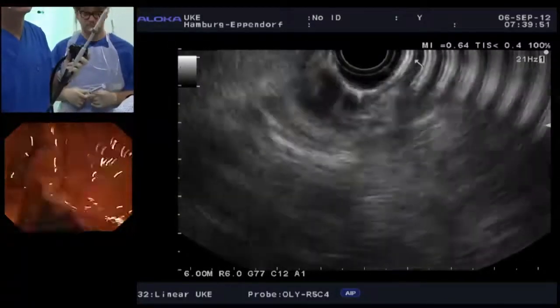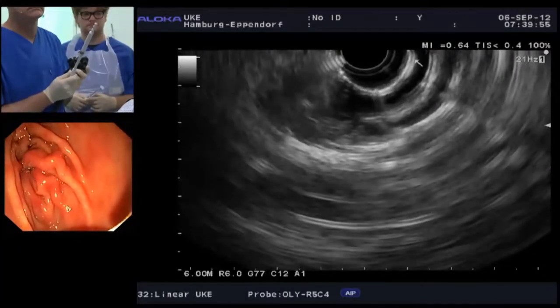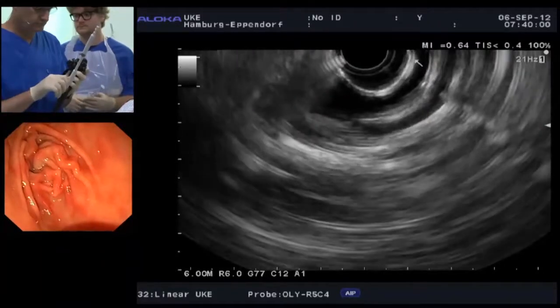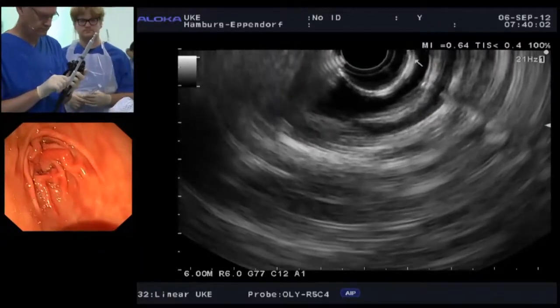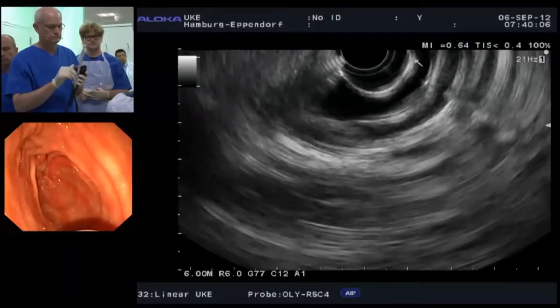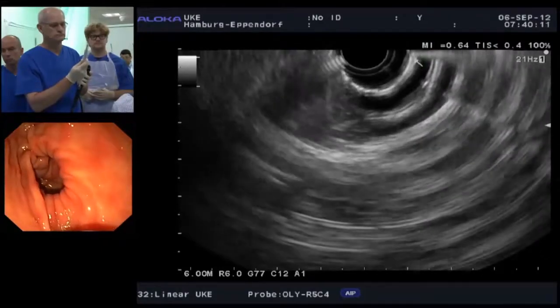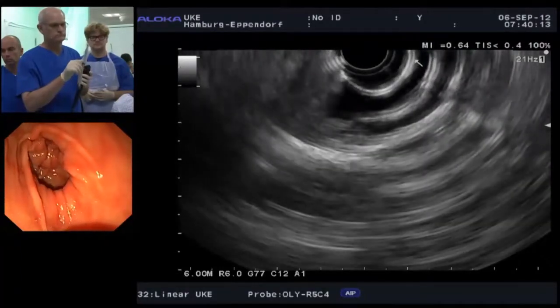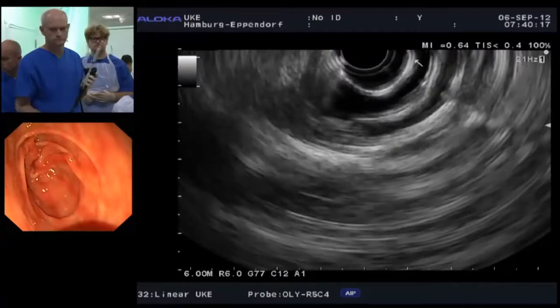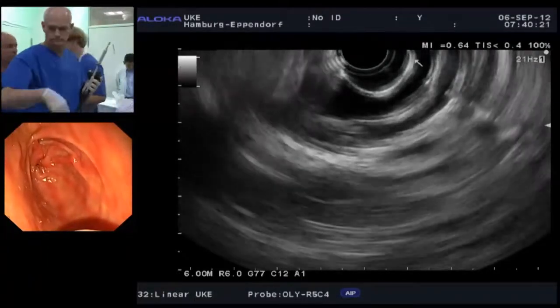Rob, if I add a few comments on that, I think if we do contrast-enhanced EUS on this case, if it is a pancreatic adenocarcinoma, then it will not show any strong enhancement. I think there are a couple of experts on this area. And if it is an inflammatory process, it will show diffuse enhancement. So I think it can be helpful for the differential diagnosis. But anyway, we need to get some sample to get the definite histology. I think the issue at hand is to get a biopsy.